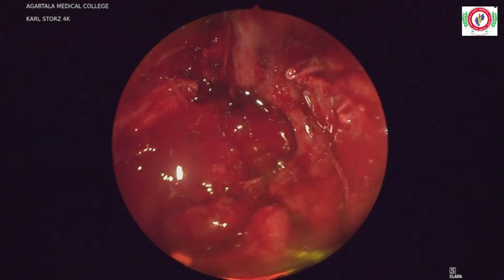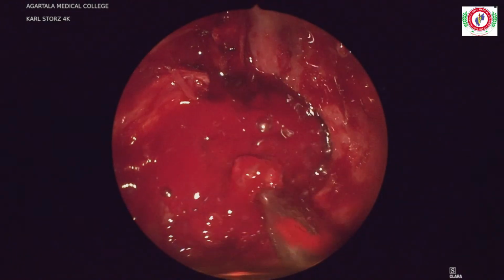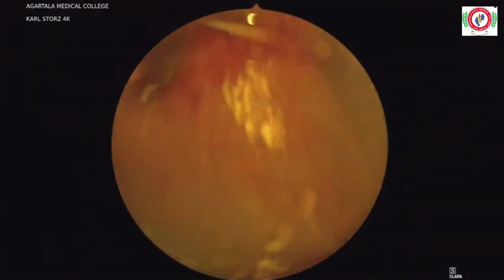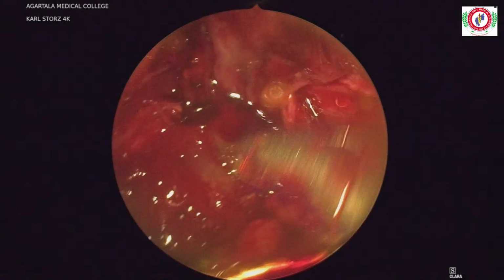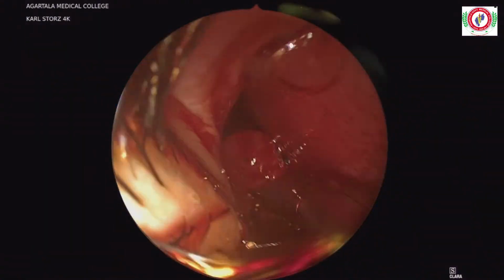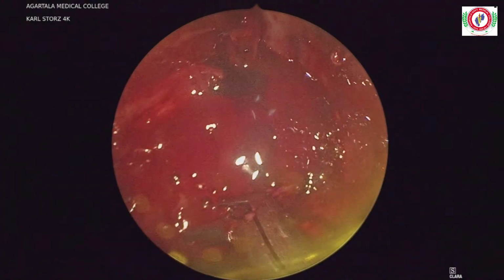I am just teasing this mucosa with my suction tip. Upturned forceps. Take this biopsy. Take a biopsy.